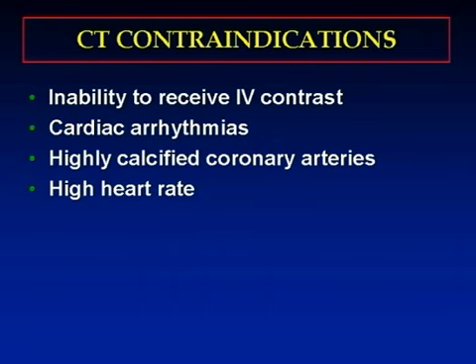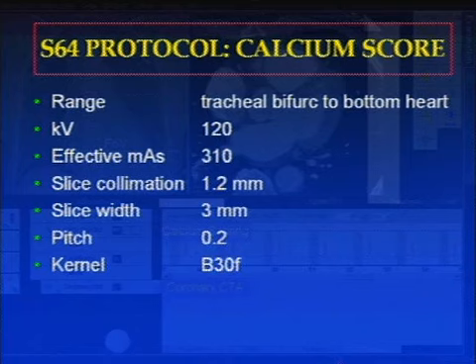Obviously, anyone who can't receive intravenous contrast material can't have the study. Patients with significant cardiac arrhythmias, highly calcified coronary arteries, and high heart rates are actually relative contraindications, and we'll discuss that in a little bit.